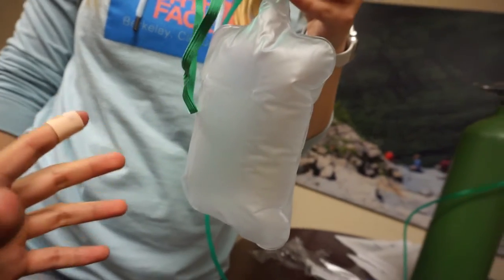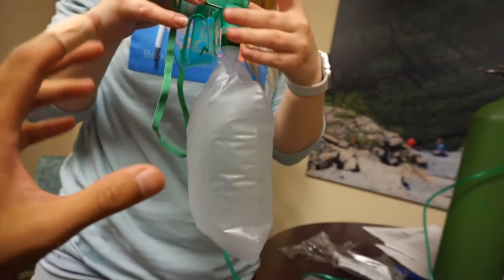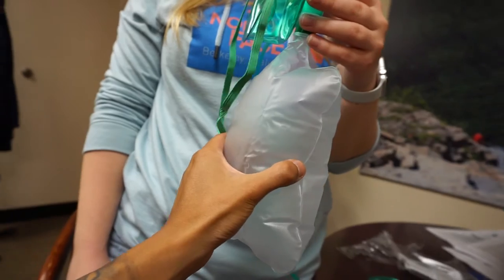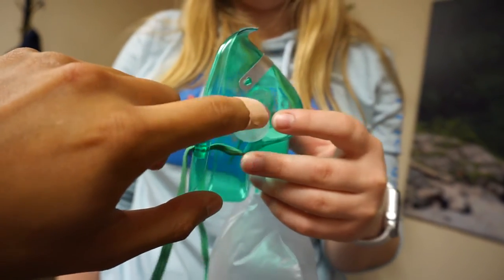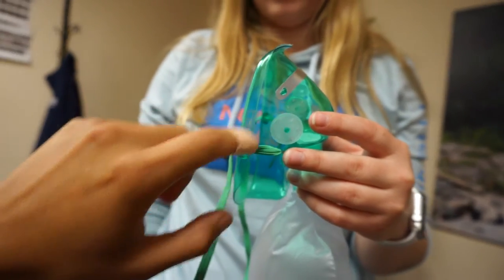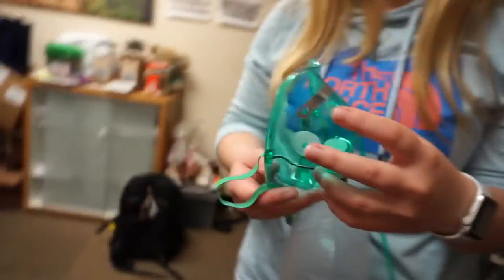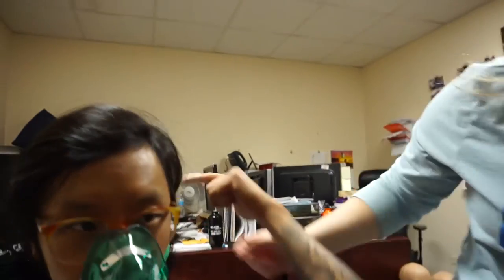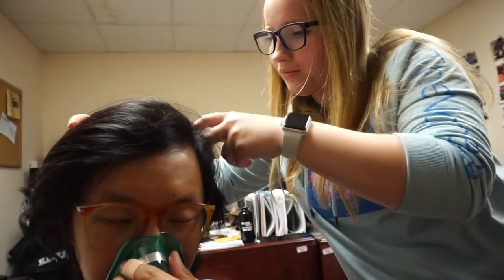Crank it to 15 liters per minute, then plug the hole on the reservoir bag to allow it to fill up with oxygen. How this device works: when the patient breathes in, they're inhaling close to 100% oxygen from the reservoir bag, and when they exhale, their CO2 exits through one-way valves on the sides. Go ahead and apply the mask onto the face, take the strap and go around and over the head, then coach the patient to breathe slowly and deeply.